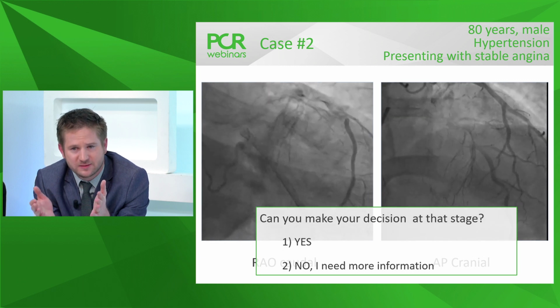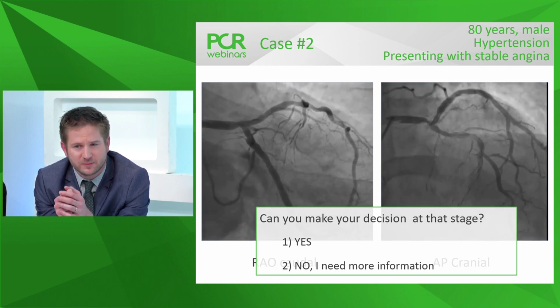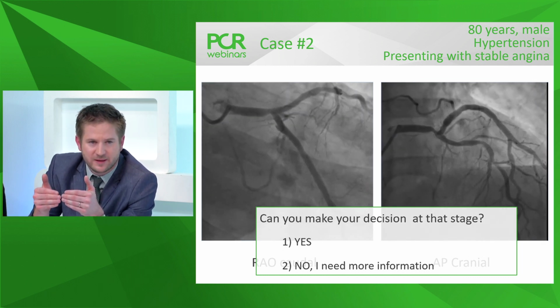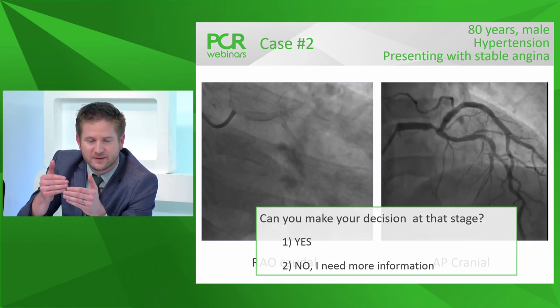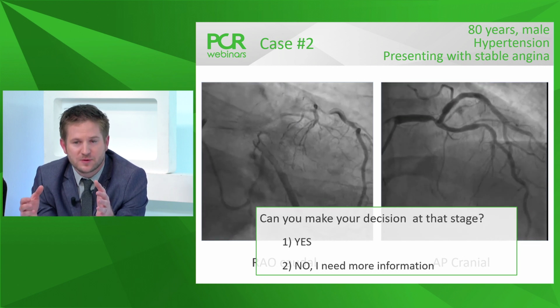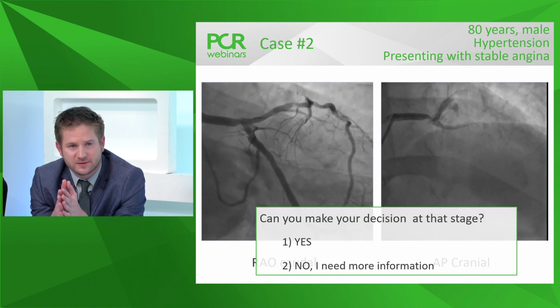To understand this, we can do a pullback FFR measurement under maximal hyperemia. With pullback, we can individually evaluate each lesion, mid LAD, a bit more proximal LAD, and the left main. In this way, we can understand which lesion or lesions are responsible for the ischemia in the LAD territory if the sum is measured as significant.